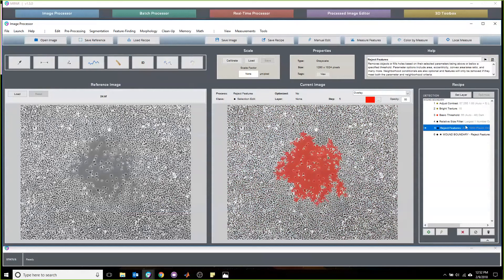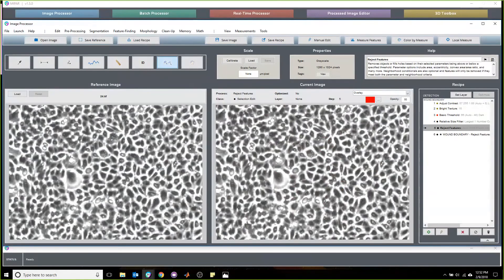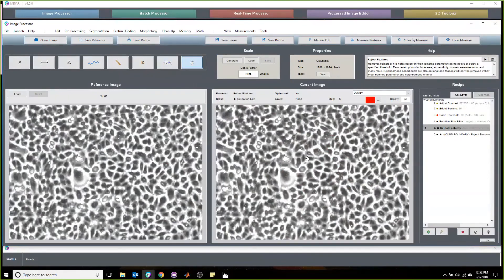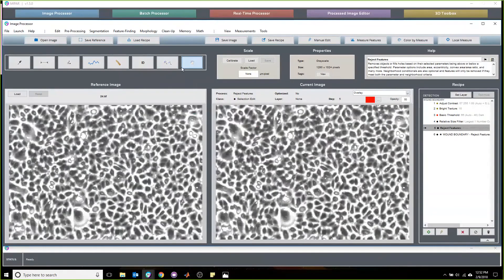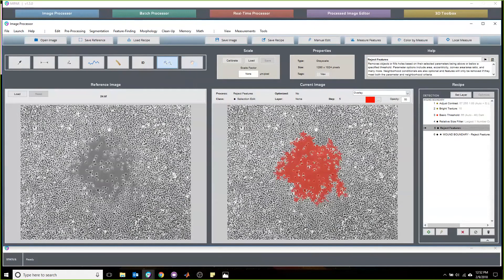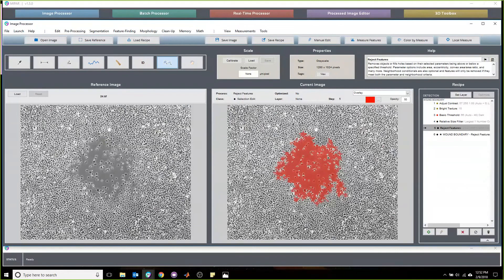This is really useful because oftentimes when cells around the edges get incredibly dense, it's hard to differentiate between the texture in incredibly dense cells and in the wound itself. So removing something around it is actually really helpful.